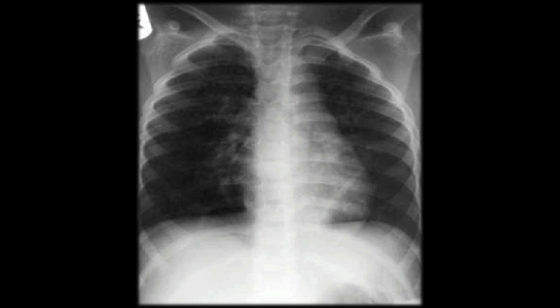Do we have any flattening of the diaphragm? Well, we know that in a normal patient, your right diaphragm margin is going to be higher than the left, and we can draw a line across here, and we definitely do have a difference in height. So our diaphragm flattening is not as pronounced as maybe somebody we would see in chronic COPD or a patient with long-standing asthma years and years and years. So we definitely have hyperinflation.